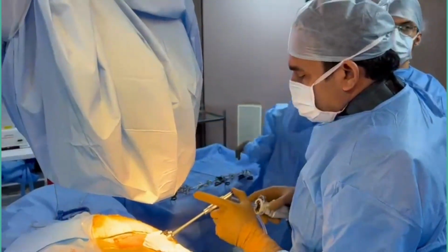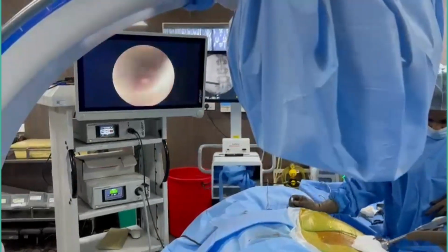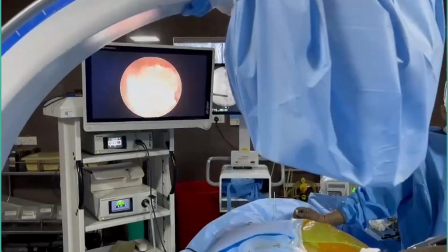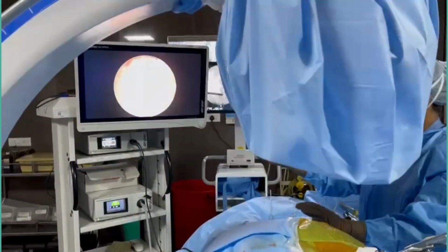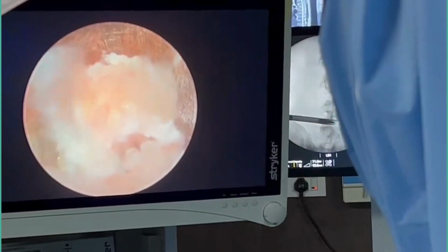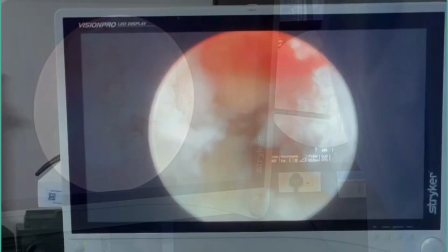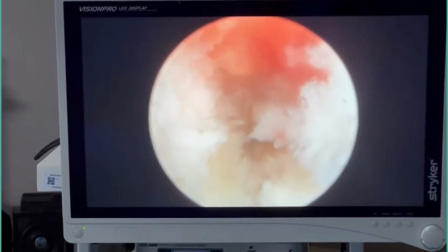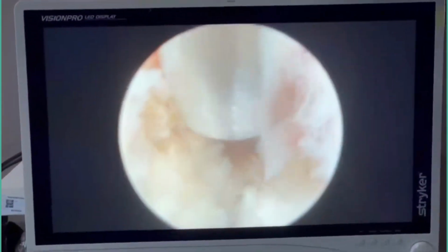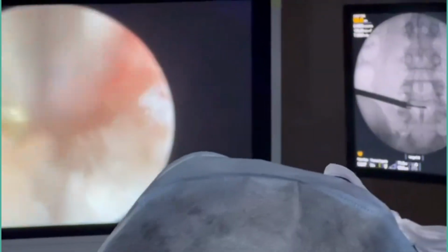Lights off. Starting. Okay. Yeah, everything done. Rotate it. One more. Okay. Is there any pain in the leg now? I'm just pressing on the leg right now. My doctor is pressing on the ankle before surgery. Just tell me how the pain is.